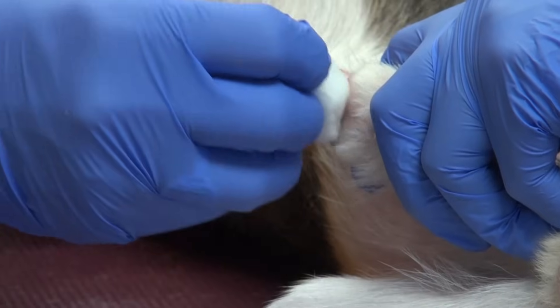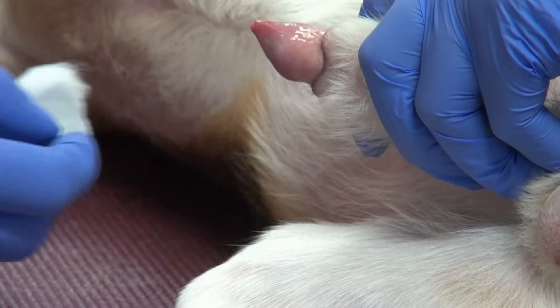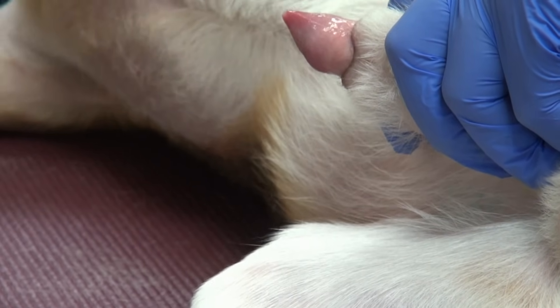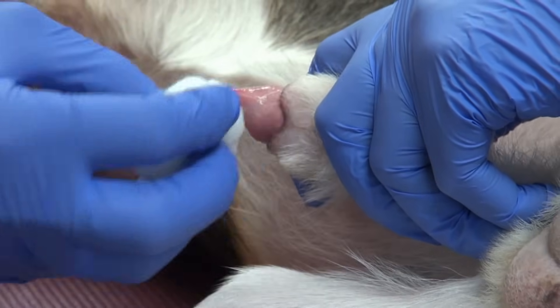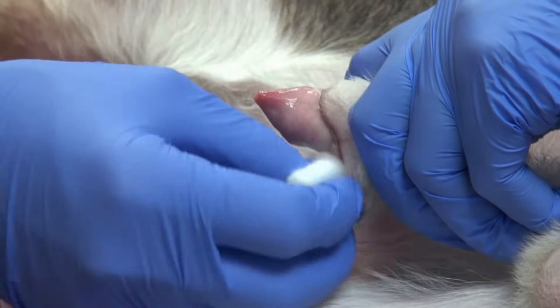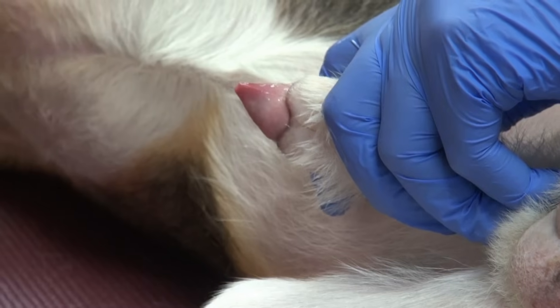Next, the tip of the penis is gently cleaned with diluted soap solution, and thoroughly rinsed with sterile water. Note that because many of the dogs used in this laboratory have atopy, they are extremely sensitive to surgical soap, and that is why we are using Etiderm solution instead. In the hospital, we routinely use chlorhexidine surgical soap.